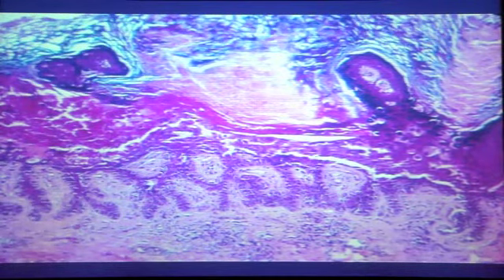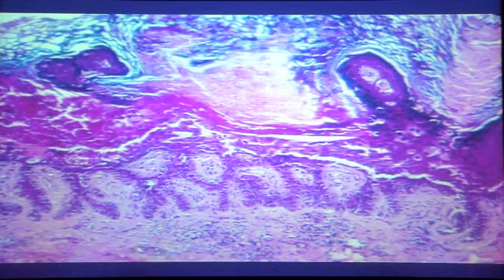The cells are falling apart, and then the cells are dyskeratotic. Now these are the so-called corps ronds and grains. All that means is a grain is an acantholytic dyskeratotic parakeratotic cell, and a corps rond is a dyskeratotic acantholytic granular cell, as you see here, or spinous cell. So there's nothing specific about this. It's seen in any of these diseases that give you acantholytic dyskeratosis.